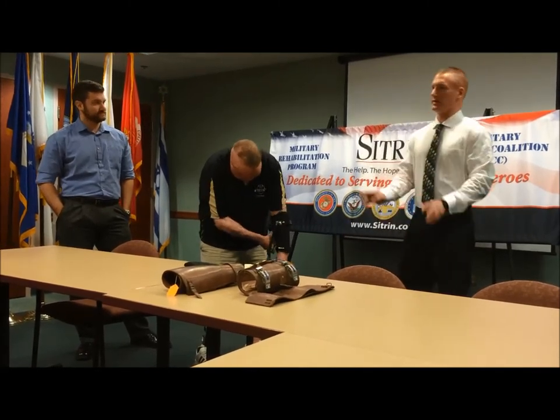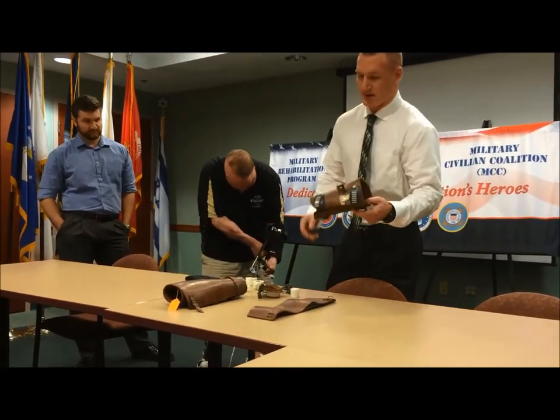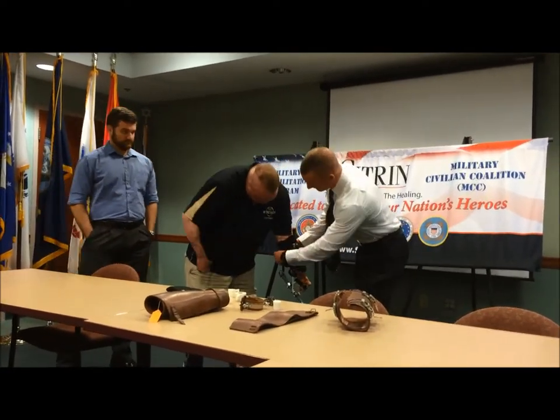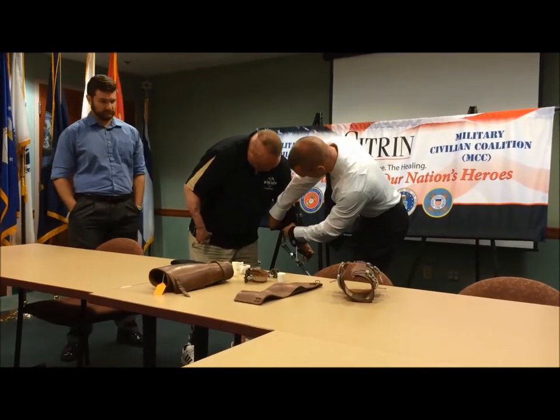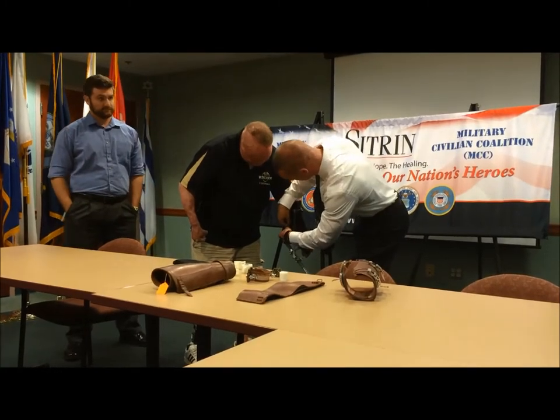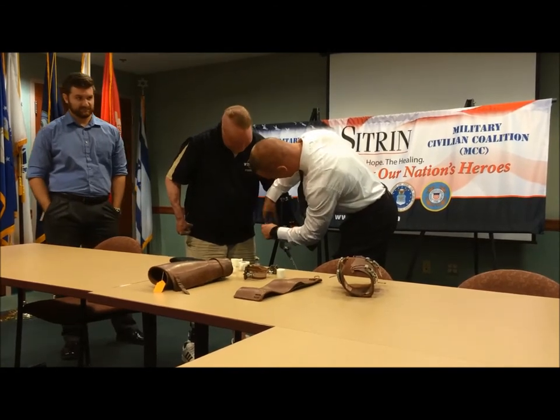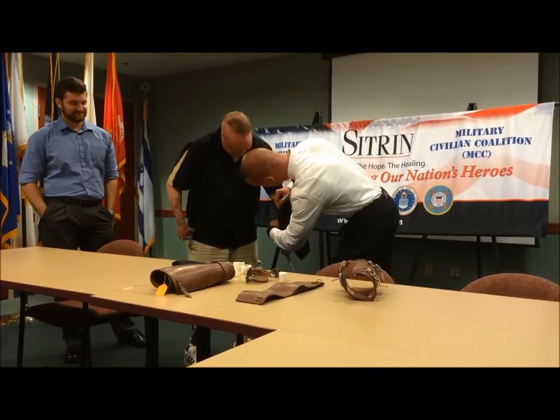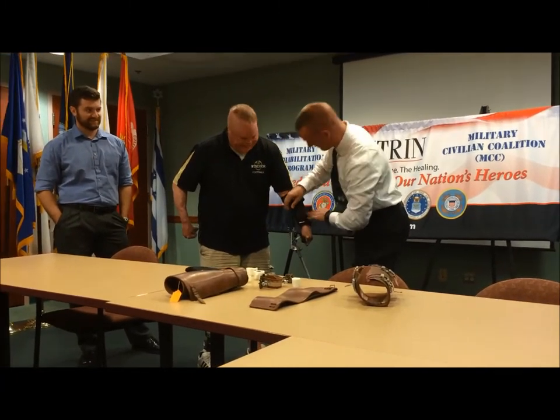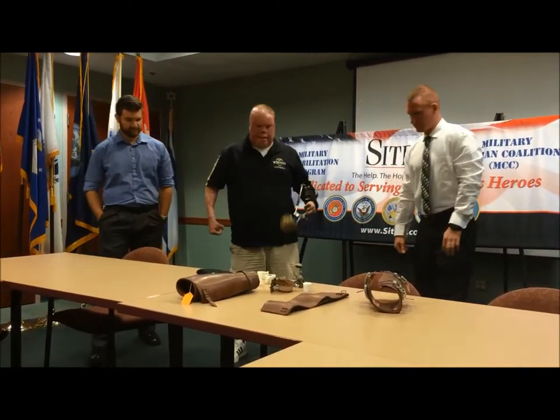We only met with Rick twice to try out this concept. The first time we used this leather cuff here, and the second time was a slightly modified version of what you see here. The second time we met, Rick hit about 20 golf balls. Some were hit, some were not. I think he did fairly well when he hit them. Rick wasn't necessarily hugely satisfied with how he was hitting them, but — that's golf. That is the game of golf.